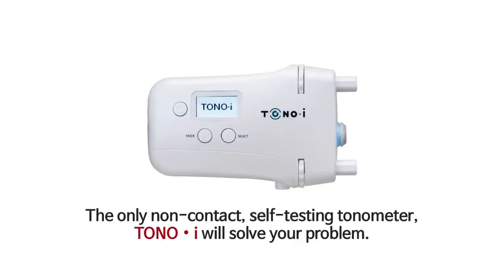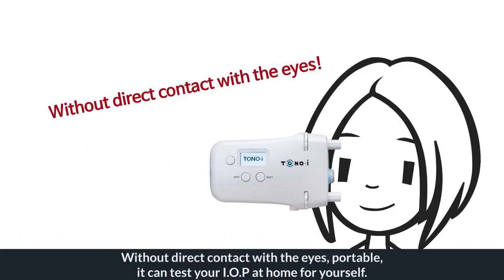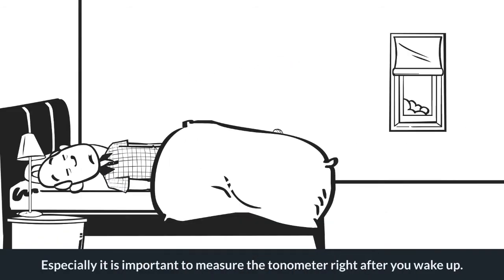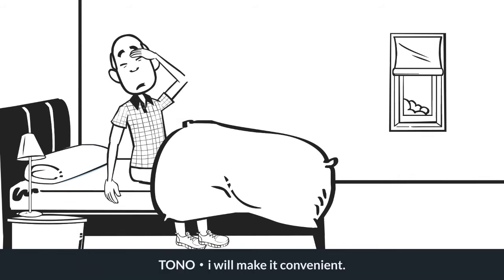The only non-contact self-testing tonometer, TONO•i, will solve your problem. Without direct contact with the eyes, and portable, it can test your IOP at home by yourself. It is especially important to measure with the tonometer right after you wake up — TONO•i will make it convenient.